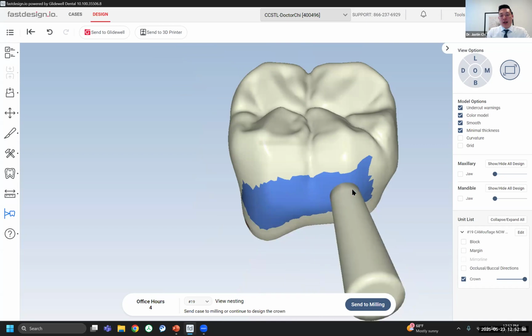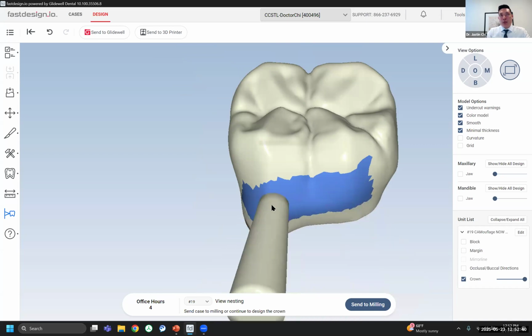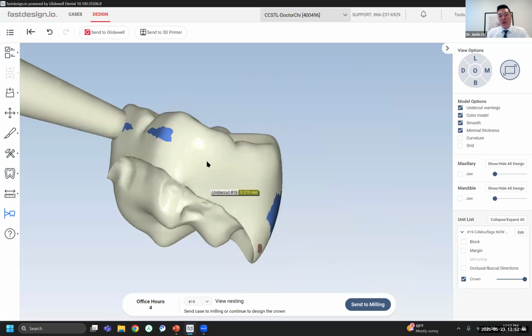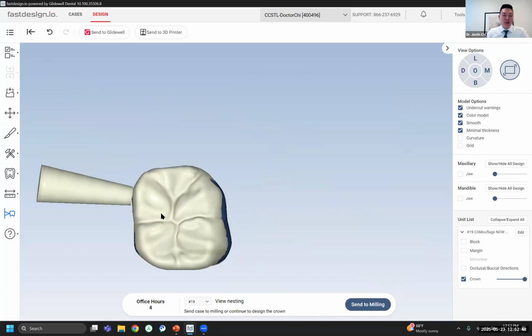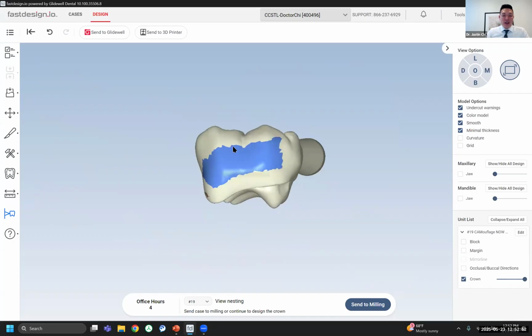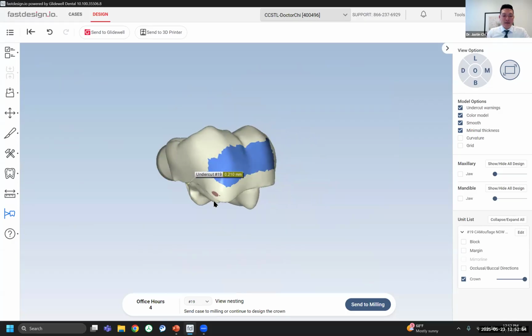I think it's due to hiding any residual sprue. That's why most of you will choose the lingual. And I'll admit, I also am a lingual-sided sprue person myself. So we'll go back there.